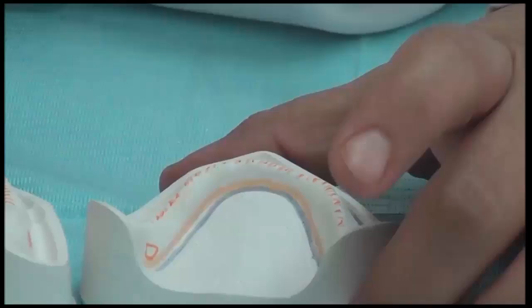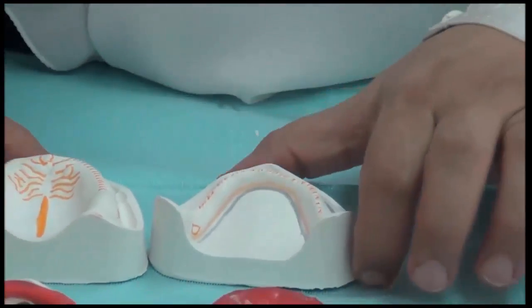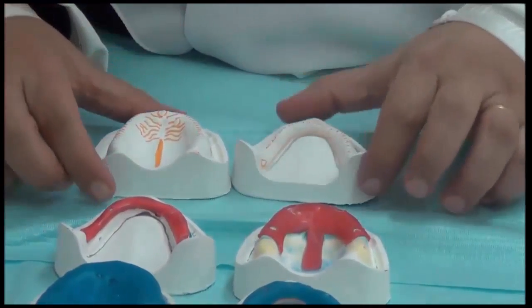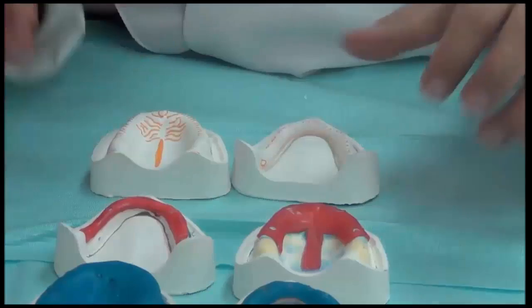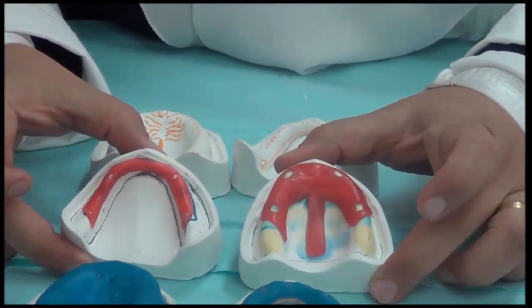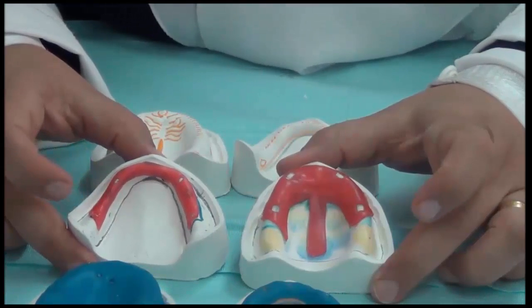Now, for us to make the tray not press too much on the tissue while taking the impression, and this is called selective pressure technique, we can do more than one procedure. We could select the areas where we pressurize and the areas that we want the impression to be static by placing wax beneath the tray.